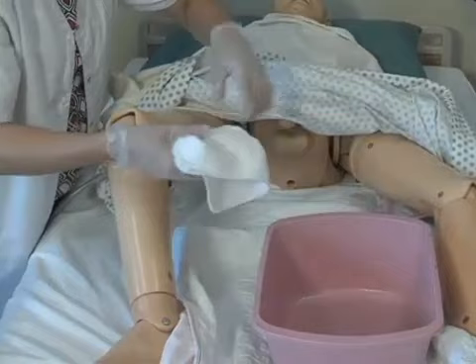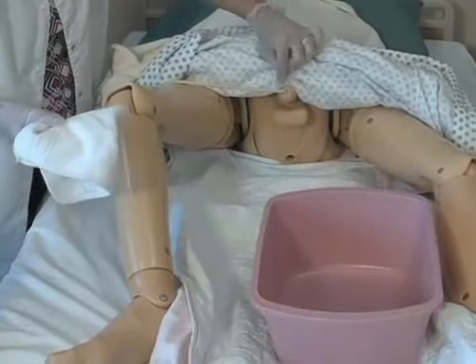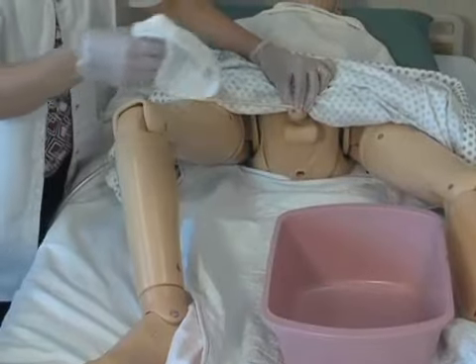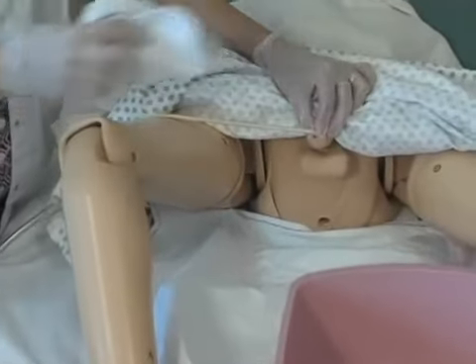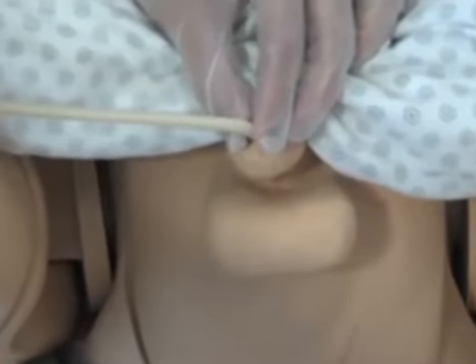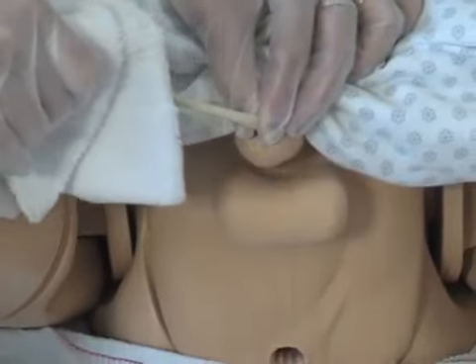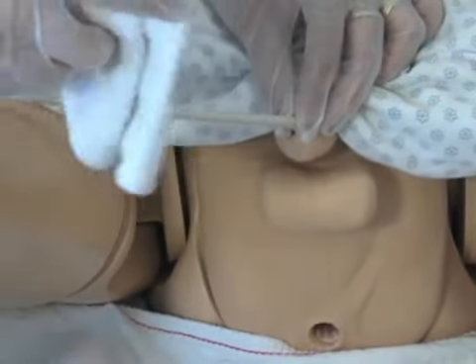Now, it's important that you hold on to the catheter right at the meatus. So when you clean, you won't pull the catheter out of the patient. I'm going to get my towel, my washcloth wet, and I will clean from the meatus out at least 4 inches.